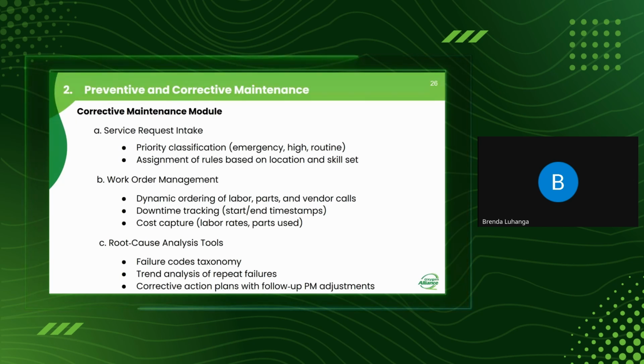And finally, the root cause analysis. If there is medical equipment that keeps on failing or fails repeatedly, you need to do the root cause analysis to come up with failure codes and also devise proper corrective maintenance options that would work efficiently on such kind of medical equipment.